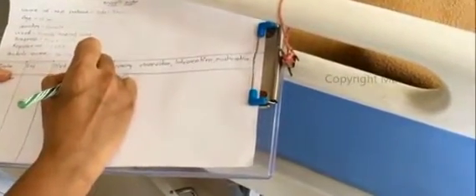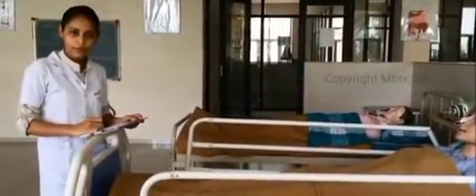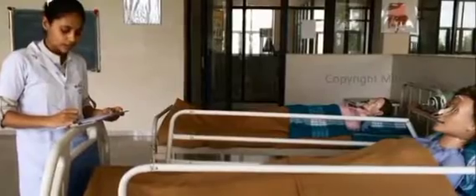Now we will write into the nursing record. In the nursing record, while writing about the NG tube insertion, we have to mention the date on which we have done it. So we can write today's date, 19/6/2020. The time, that is morning 9 a.m. In the nursing notes, we have to write which size of Ryle's tube we have used. Here I have used 16 French, and we have to mention in which nostril we inserted it.